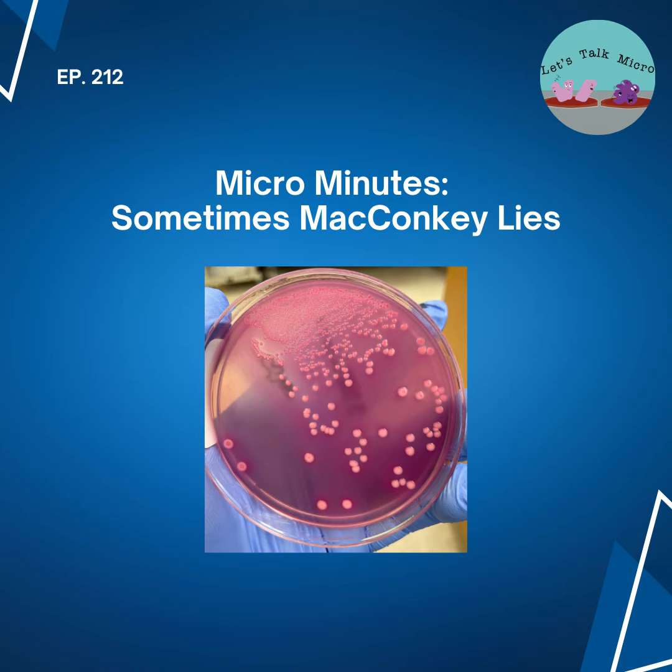Well, that is wrong, because that's how you misidentify Pasteurella, Haemophilus, Eikenella, which are the ones that you commonly see in the lab. There are also the ones that you're hoping you don't see, right? They're less common, but they might come across your bench, like Brucella and Francisella. So this is myth number 1 when it comes to MacConkey: if it doesn't grow on Mac, it is not a gram-negative rod.